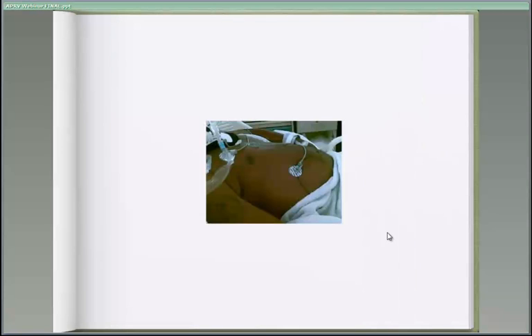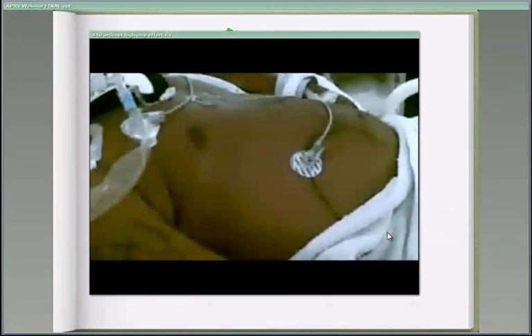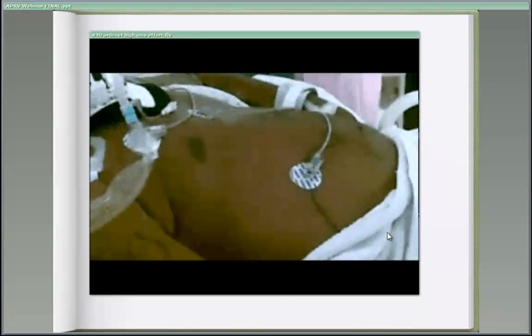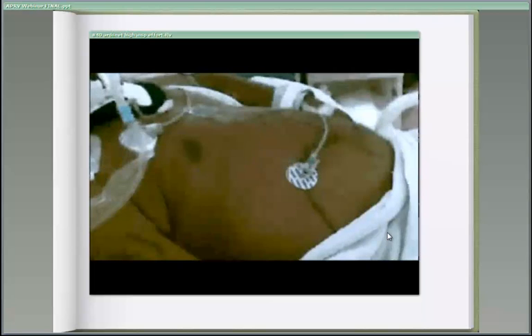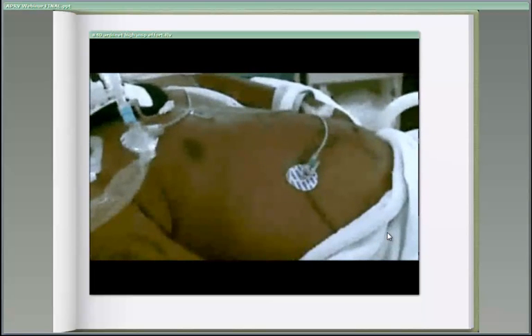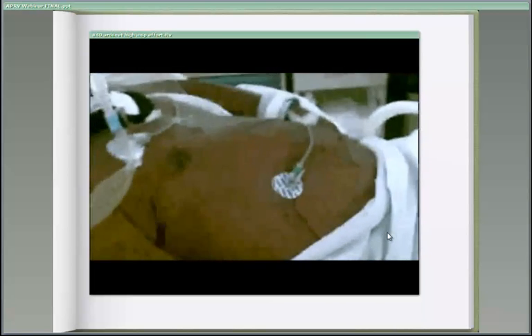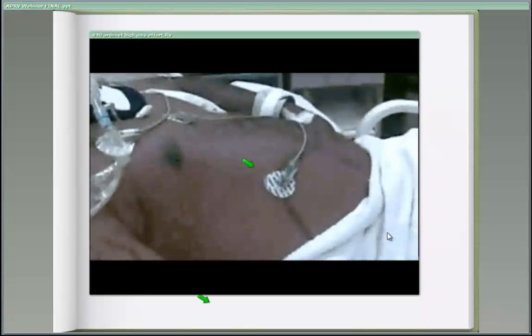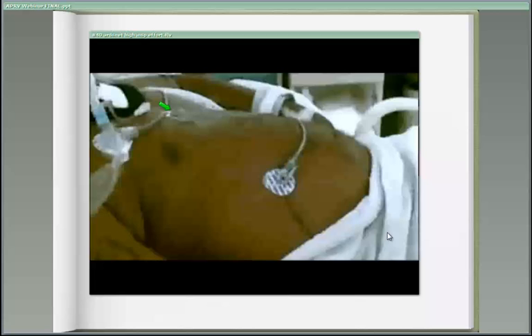In fact, I'll just show you an example of an ARDSNet patient. And if you look at patients who are breathing, you might see that their sternum actually gets sucked in because of flow limitation. And flow limitation is a big cause of distress or dyspnea in a ventilated patient. In fact, there's a recent study that suggests that's one of the biggest things, the flow limitation. That's one of the key things you need to do to actually precisely control volume. In fact, that's the best way to control volume.